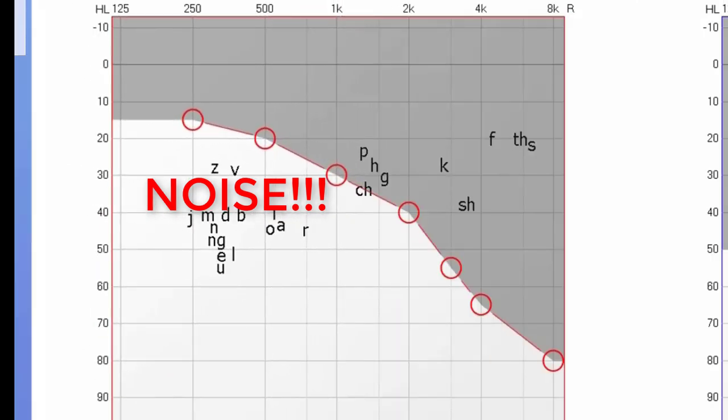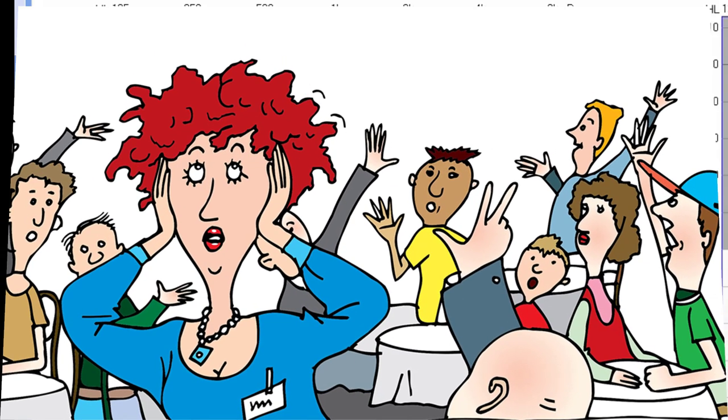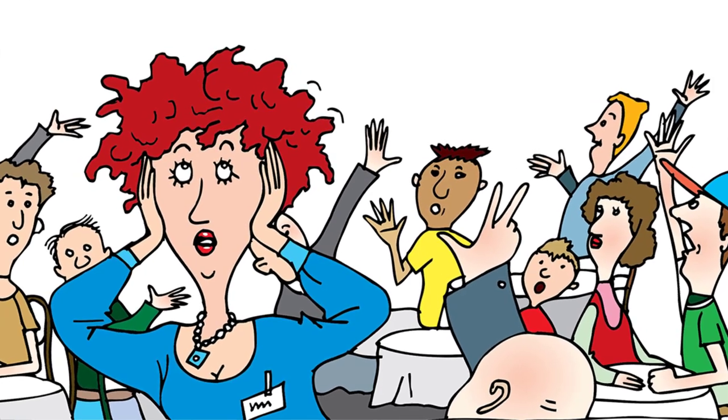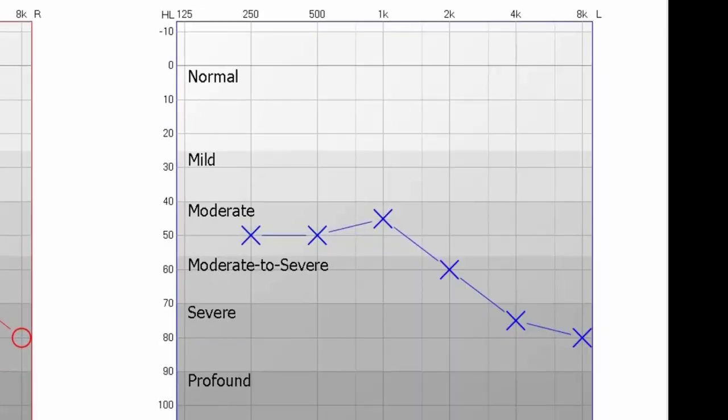According to the test results, this individual would hear background noise really well because of their good low frequency hearing ability, but wouldn't have access to the proper high frequency speech components that are needed to help separate speech from noise. This creates a listening environment that is nearly impossible to hear in successfully.